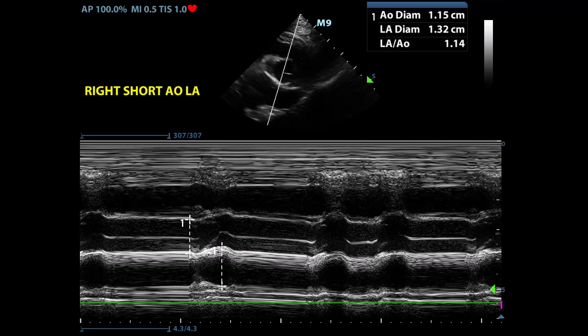During left ventricular systole, the aortic valve opens and blood is flowing through the valve. The left atrial diameter measurement is made at the middle of the aortic valve opening. At this point, the mitral valve, which is not shown, would be closed, and the left atrium is at its fullest diameter. The measurement of the left auricle, or left atrium, can be compared to a chart of normal left atrial measurements by body weight.